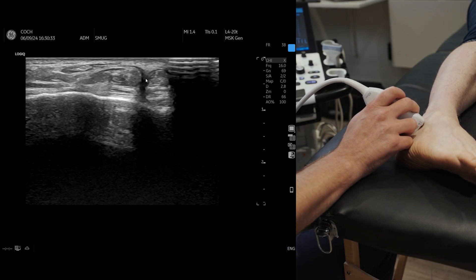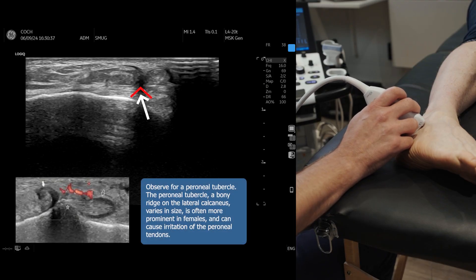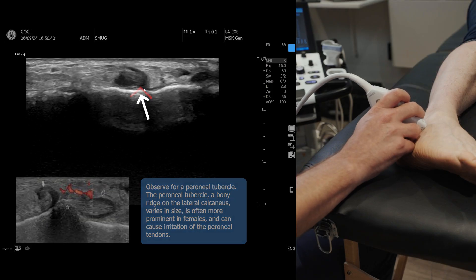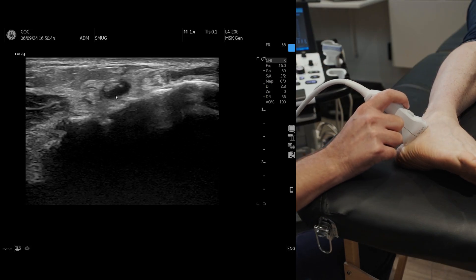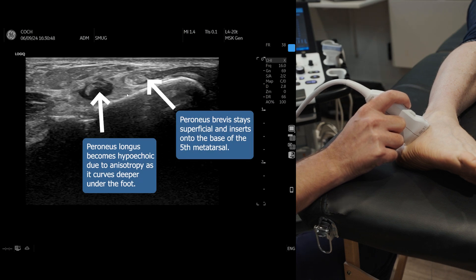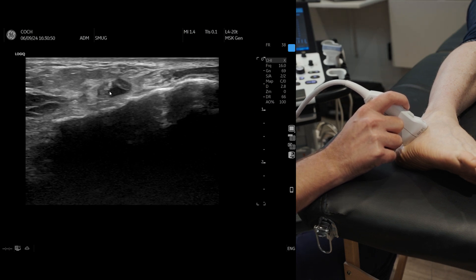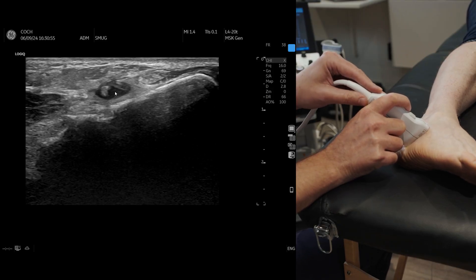As we come down, you can see sometimes there's a peroneal tubercle — more common in women than men; this is a male model so he hasn't got one. As we go down, the peroneus longus tendon will go deep, and the brevis will go onto the fifth metatarsal. We're going to concentrate on the peroneus longus, because particularly in runners around the cuboid tunnel, you can see a problem.